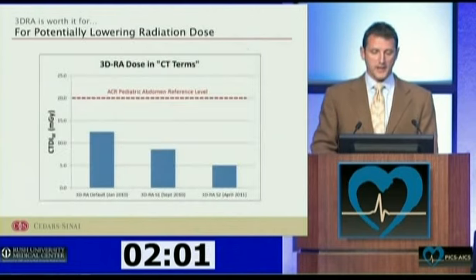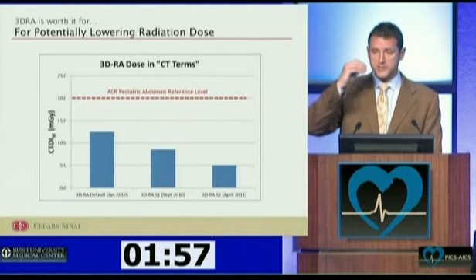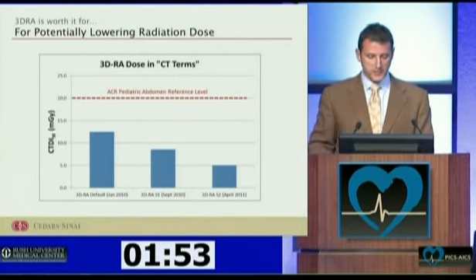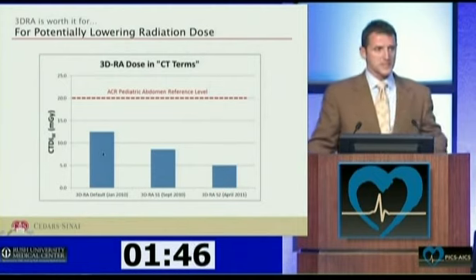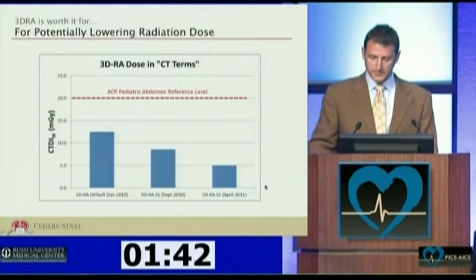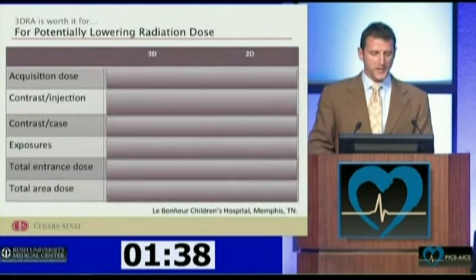Okay. Finally, my concluding remarks are about dose. We've heard a little bit about dose tonight. John showed some nice work that the Toshiba engineers did with reducing dose. This is just a graphic representation of what the 3D-RA system was giving out in terms of CT dose before it was tweaked, and you can see how nicely, and I think this is true for all the systems, dose can be managed and brought down.